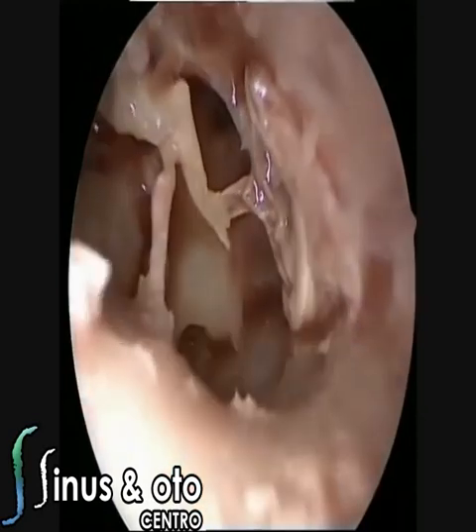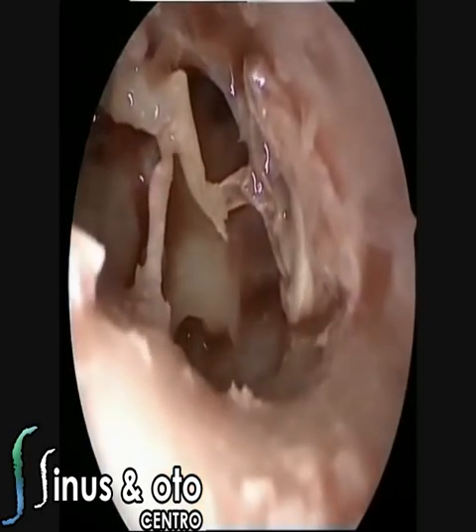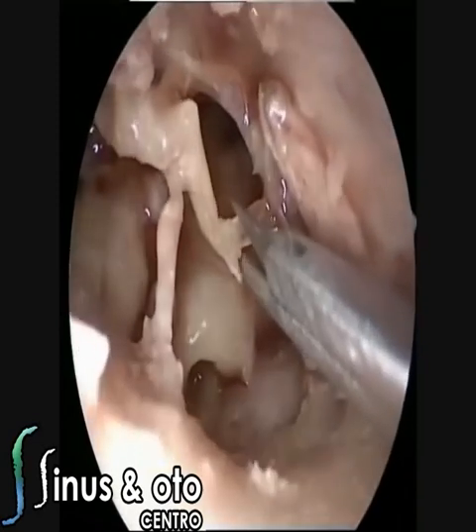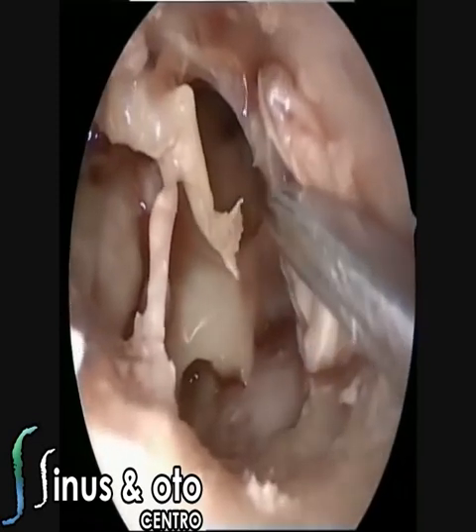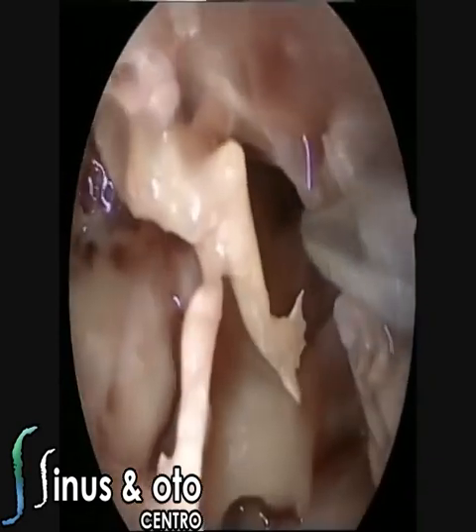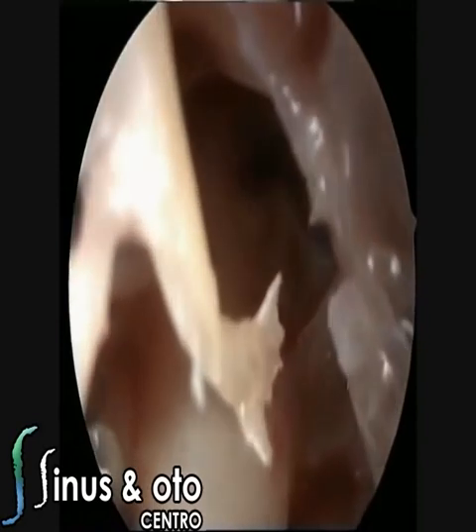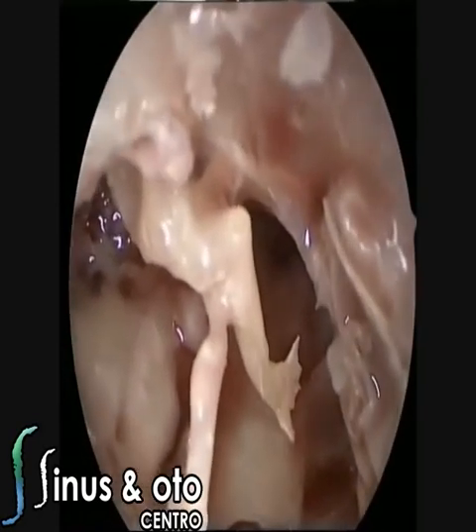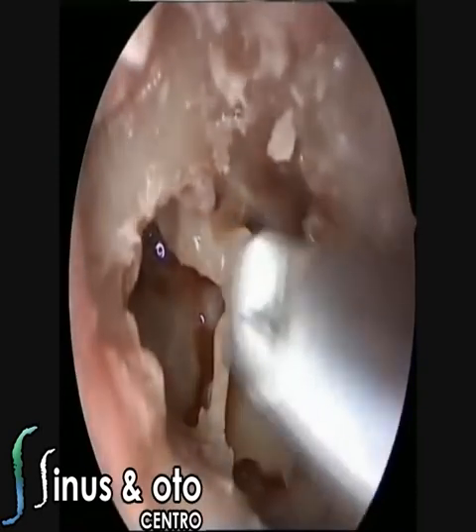Actually, it's a hidden incision that you have once you remove the perichondrium and the cartilage from the tragus, and it's a very small incision compared to the traditional post-auricular incision, or even the superior incision if you want to remove the temporalis fascia to use as a graft to reconstruct your defect.